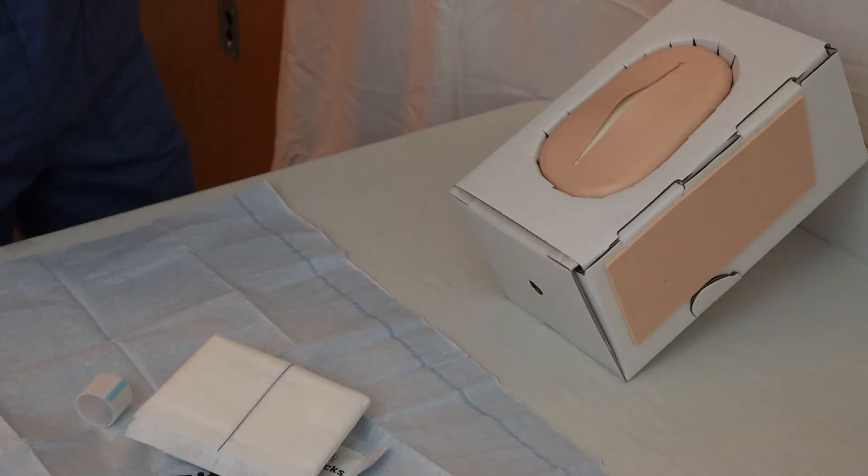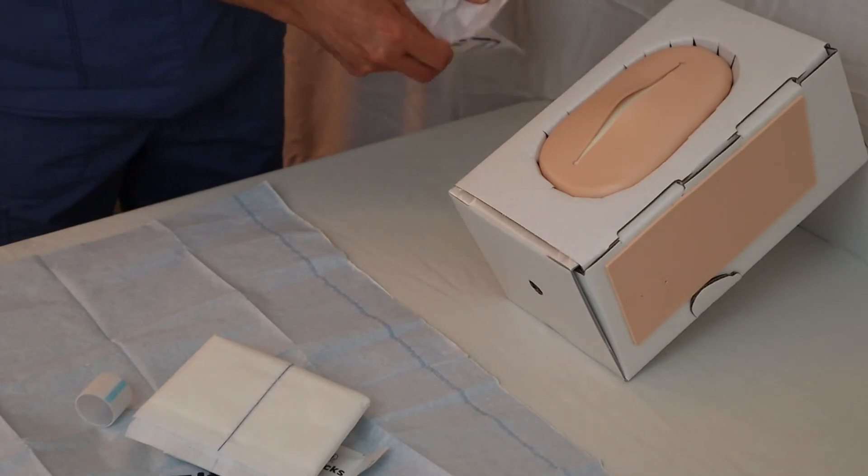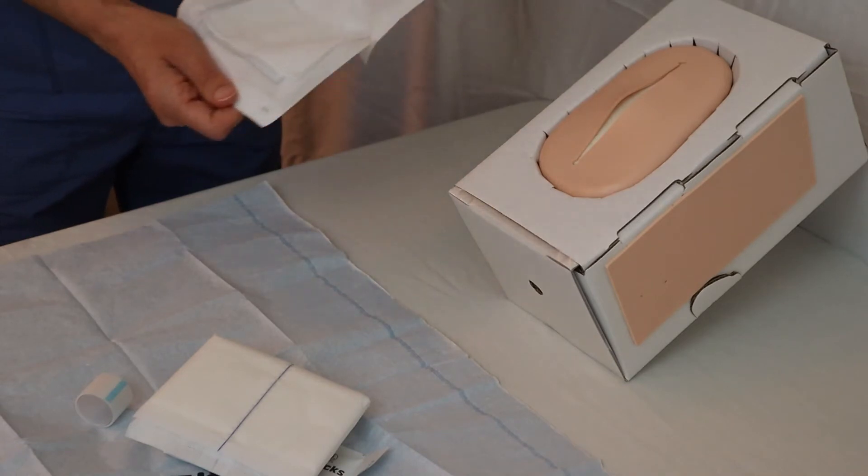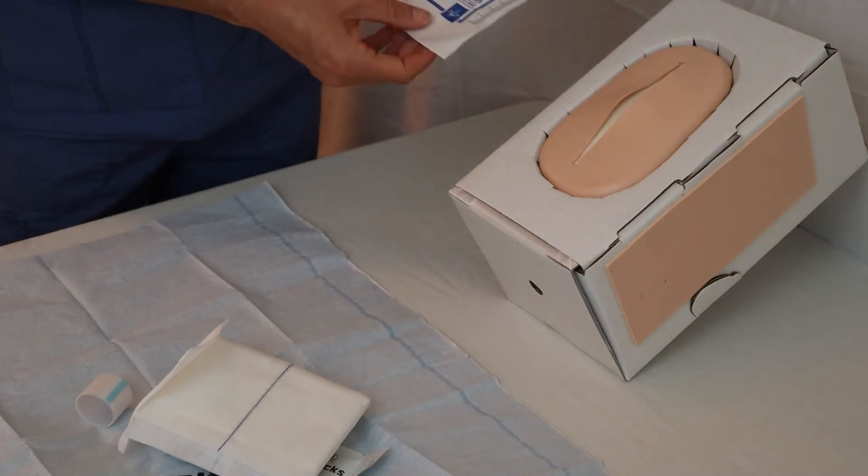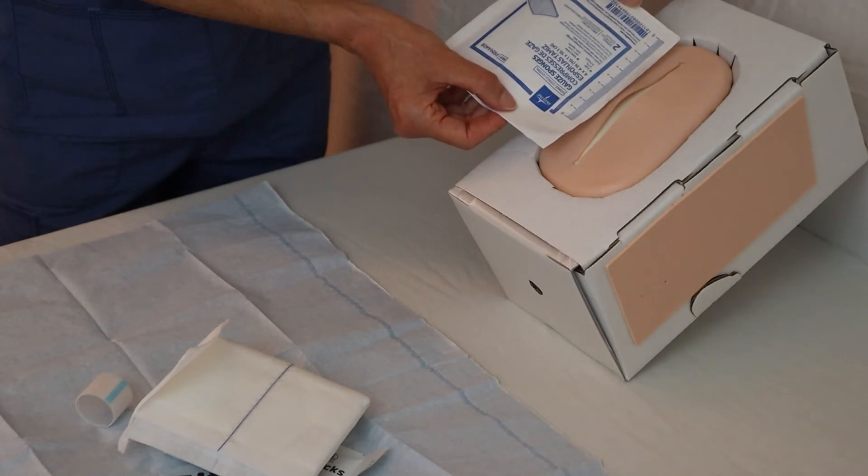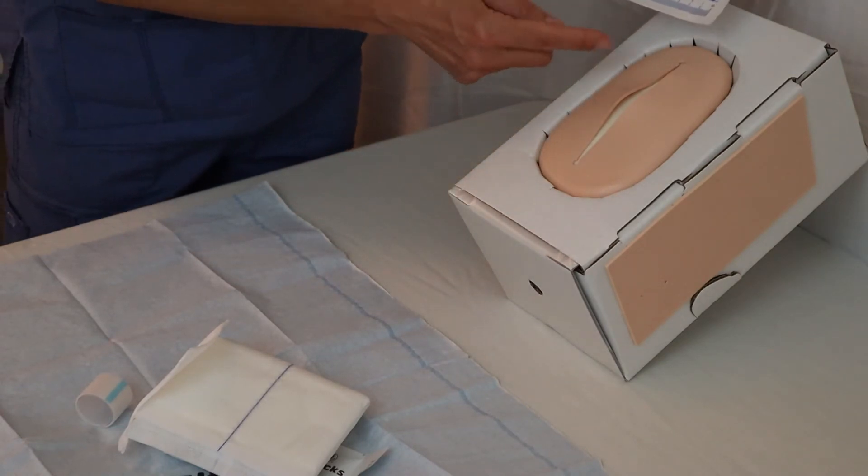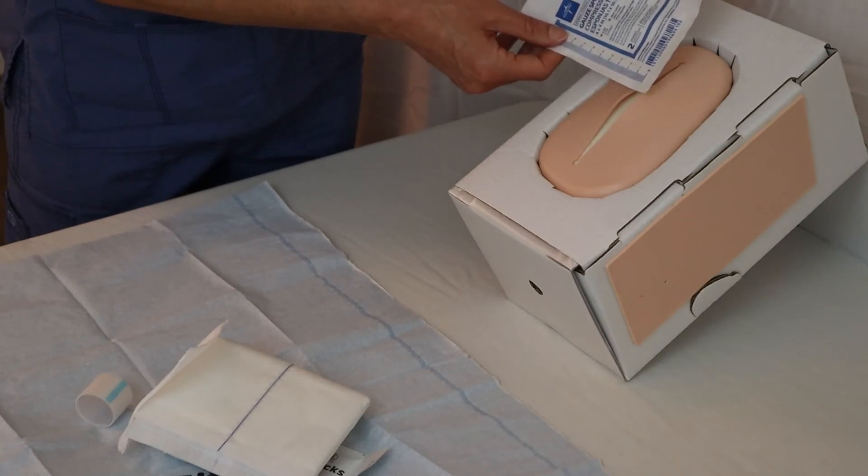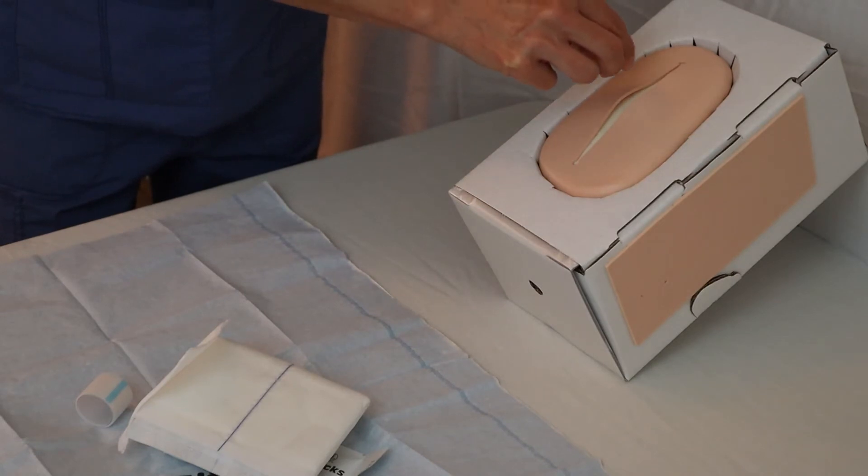If I were to use additional supplies, if I were to use this gauze that has this nice tape measure, I could just open the wrapper away from the sterile field, of course not touch the inside, and then carefully just dump it on my sterile field. In this case, I'm actually going to use the tape measure to visualize the length of the wound. There's about 11.5 to 12 centimeters long. There's not really a whole lot of width, maybe at the biggest diameter it's about one centimeter. And if there was any depth of the wound, I would have to take a sterile Q-tip and place it inside the wound gently and measure the depth.